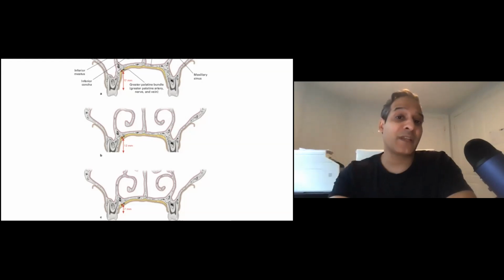And a cool trick is if you take your finger with the glove and you start a little bit posteriorly and you put a little bit of pressure, you can actually feel the pulse of the artery. So it's a way to even just locate it, and then with slight finger pressure, you'll be able to feel the pathway of the artery, and you'll be able to actually manually palpate the artery itself. So it's a good way to know where it is and then know where your safety zone is.